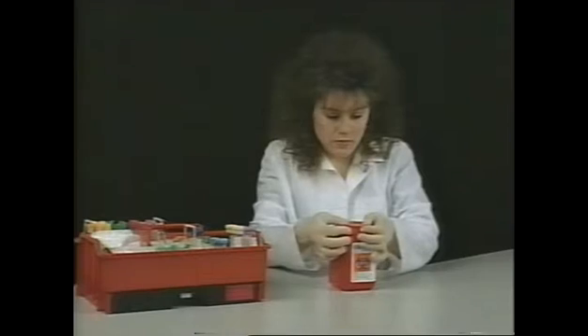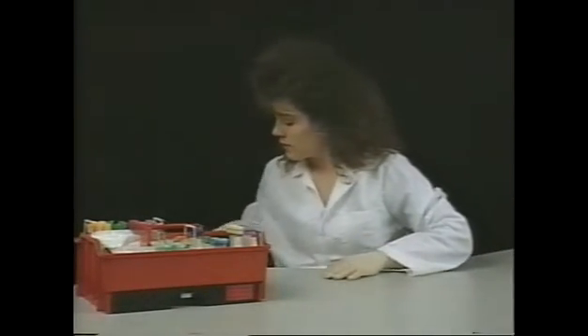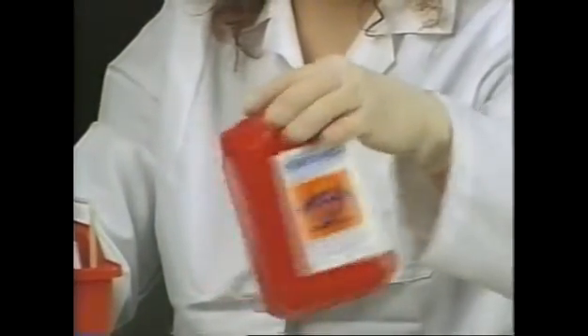Always make certain the AND is stationary and secure when using. Always operate the AND unit on a non-slip surface — we recommend using the AND bracket. Occasionally shake the AND unit from side to side to maximize the volume of needles held within the unit.